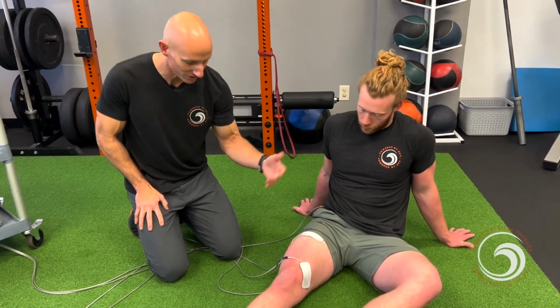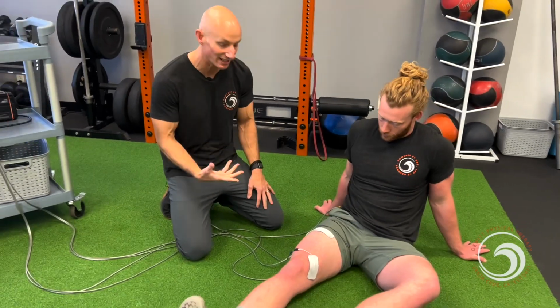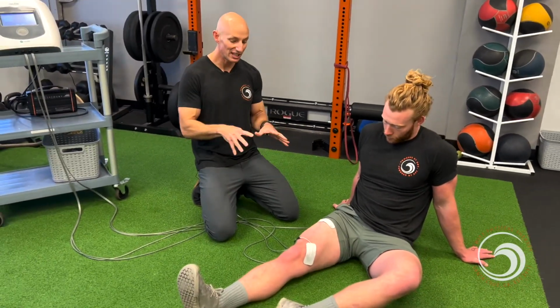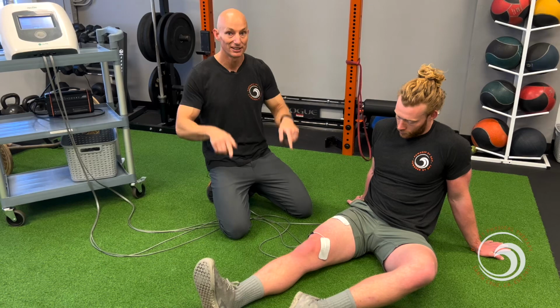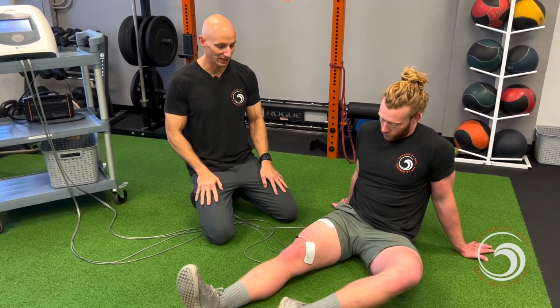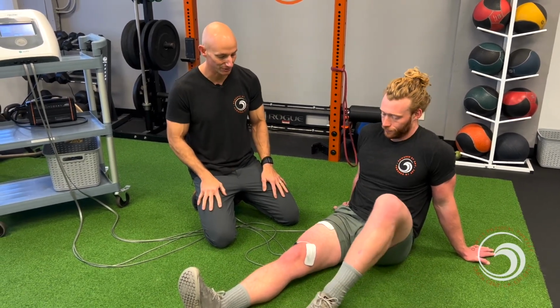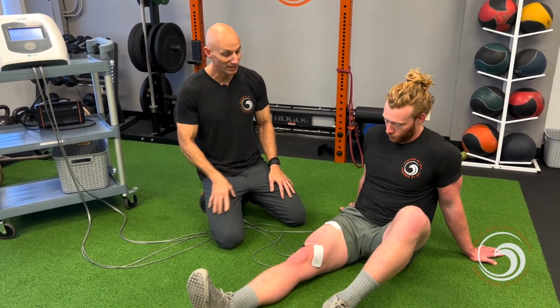So all I want you to do there is just go ahead and give me a couple of quad sets. And so we're going to squeeze, we're going to hold, we're going to work on that time under tension. The machine is really trying to make that mind-body connection and to really strengthen that neural pathway, along with getting those muscles to really kick in and recruit and fire more motor units. So we can progress from there.